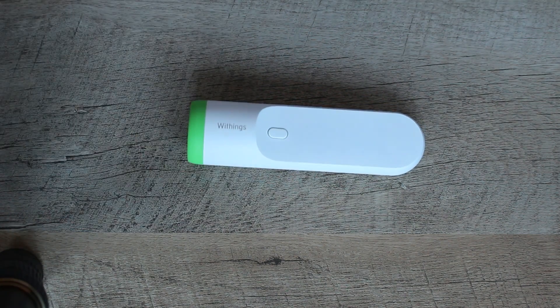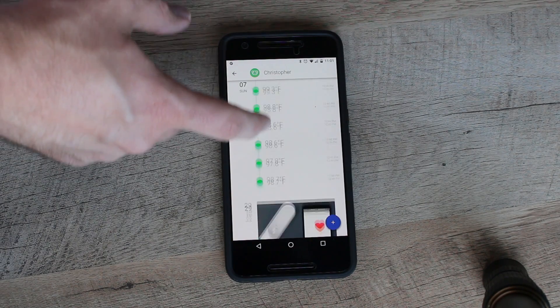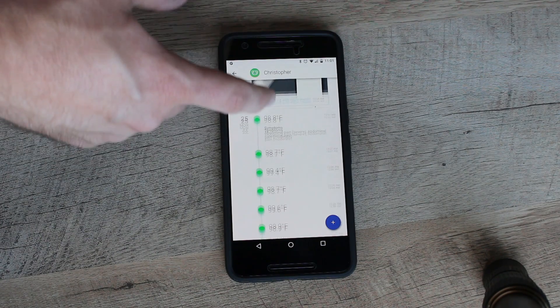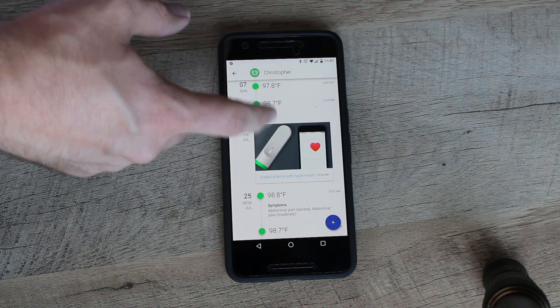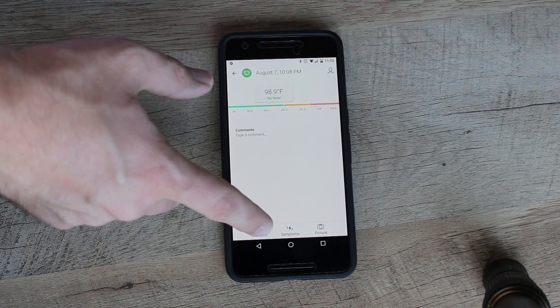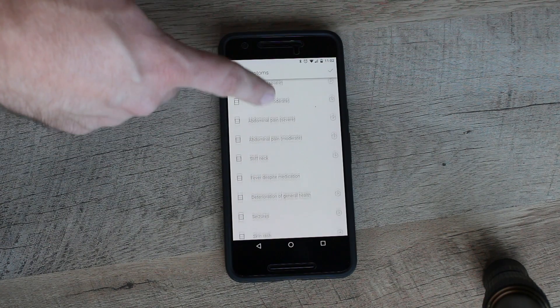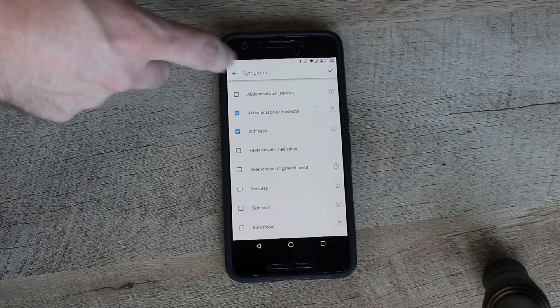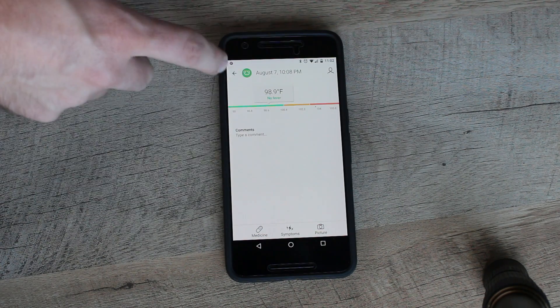You get a little green or red light depending on whether you have a high temperature or not. The application works really well and saves all those temperatures. On top of that, you can put in different things you're feeling — like if you're nauseated or other symptoms — and it'll save all the information. You can do yourself, your wife, your kids, whoever in your family could potentially use this.